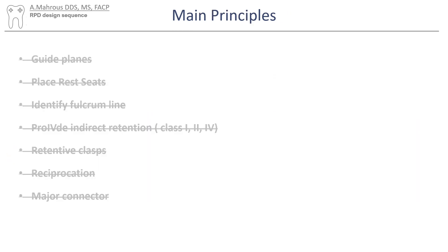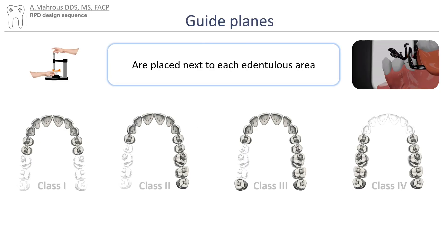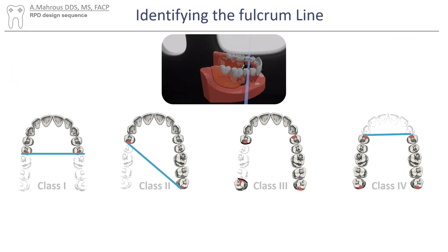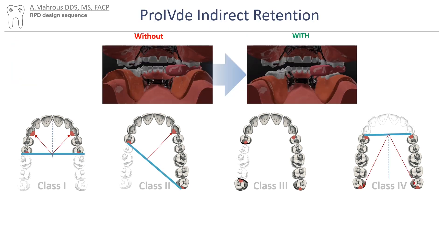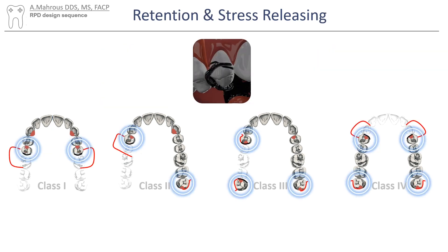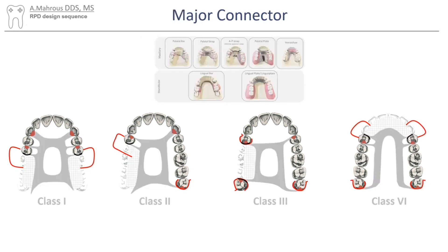With that, the steps of designing an RPD are complete. So let's do a little recap. The first thing that's added are the guide planes, followed by the rest seats, then identify the fulcrum line and then use it to determine where to place our indirect retainers. Then we add the retentive clasps, we add the reciprocal elements, and finally the major connector.